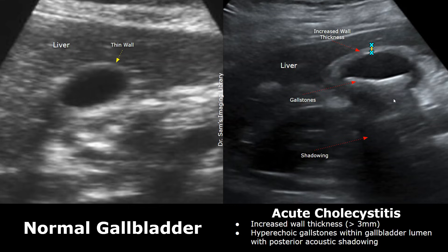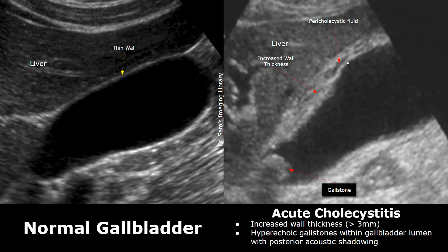The gallbladder wall is also thickened. In this image, a gallstone is present in the gallbladder's neck region, casting a posterior acoustic shadow. The gallbladder wall is thickened and there are hypoechoic areas within and outside the gallbladder wall. These features indicate gallbladder inflammation.